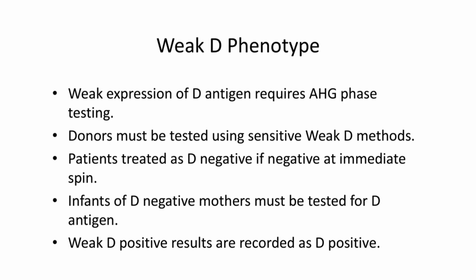Weak D phenotype. Some individuals may have a weak expression of the D antigen, known as weak D. This condition requires special consideration. If a sample tests negative at immediate spin but positive at the AHG phase, it is considered weak D positive, provided the D control is negative.